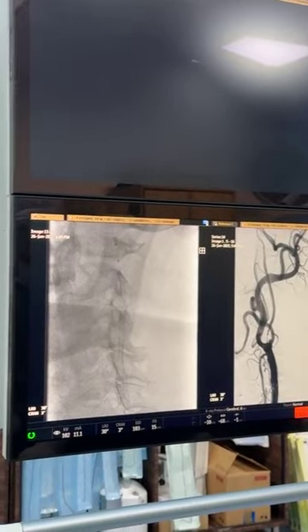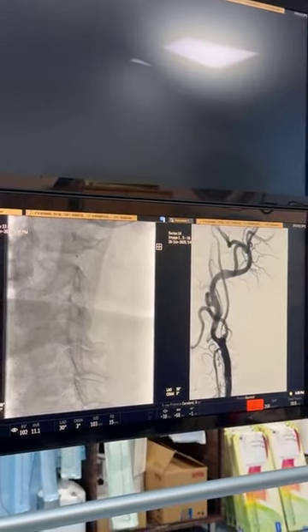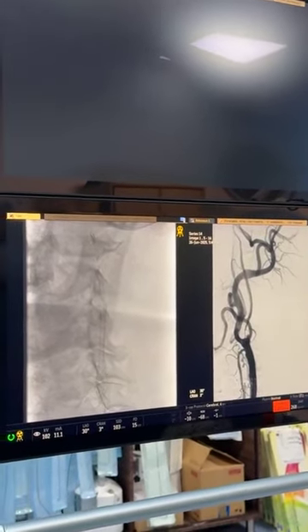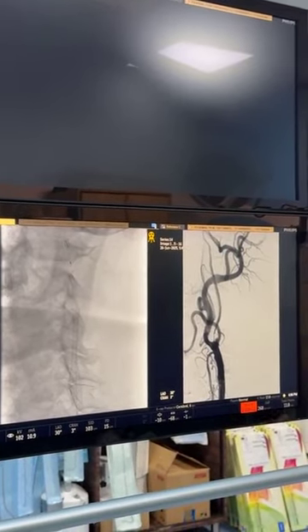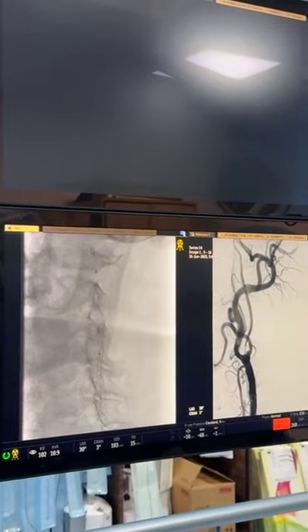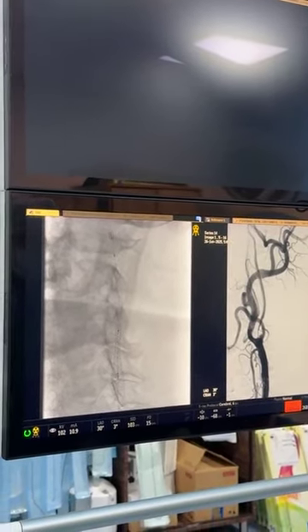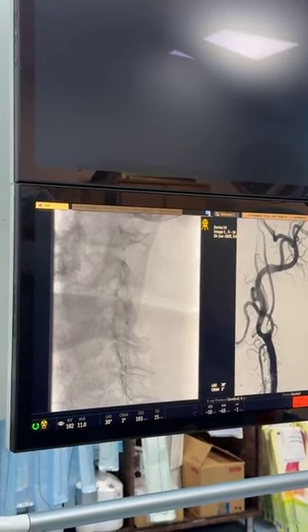And this is a self-expandable stent. That means it will try to take the shape and size of the vessel. We don't really have to do much, but a little bit of post-stent angioplasty. Generally, it should be avoided in many cases. Because we have a distal embolic protection, we can do it. Because the most chance of distal embolus is because of a post-stent angioplasty.